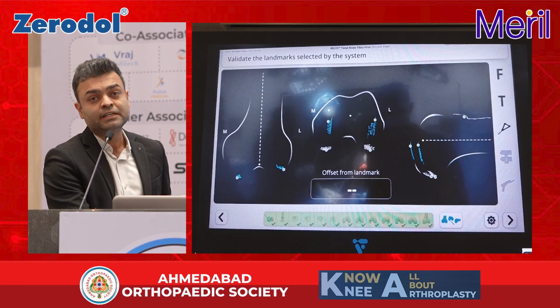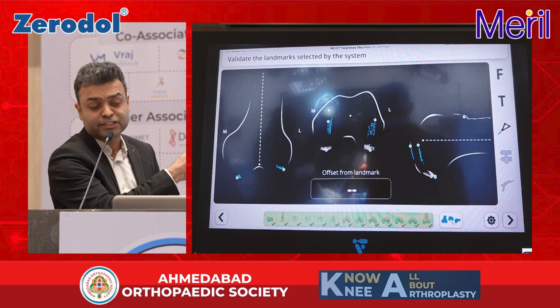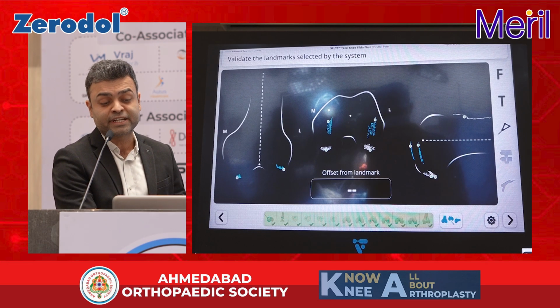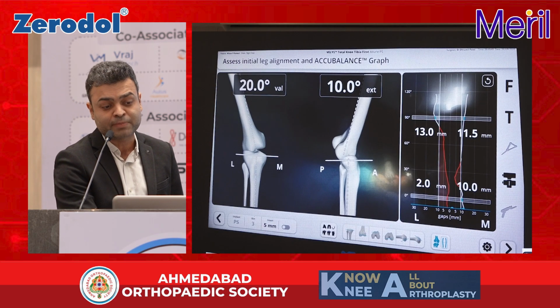This, of course, when you're using a robotic system, the advantage is that you're using mapping. The intraoperative 3-dimensional picture that you create is going to help you set your rotation of the component. So that in severe deformity can help you when you're using technology. The biggest advantage of technology is the dynamic assessment of the soft tissue balance that the patient has.